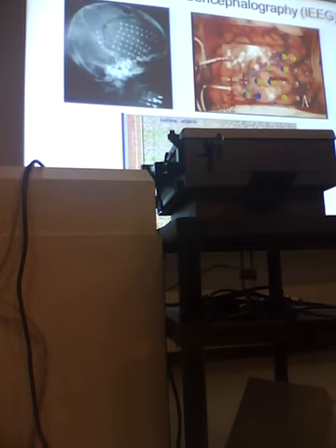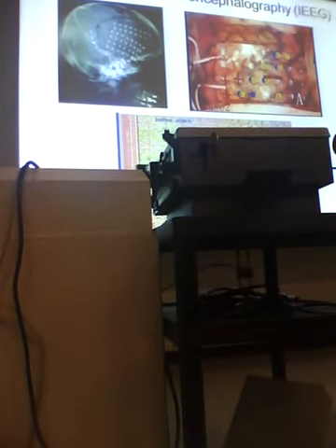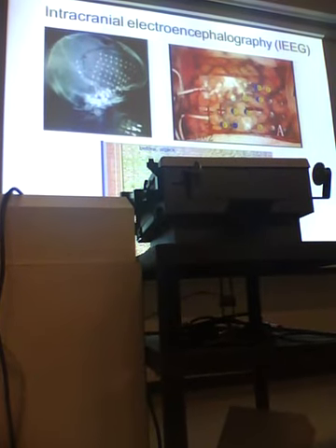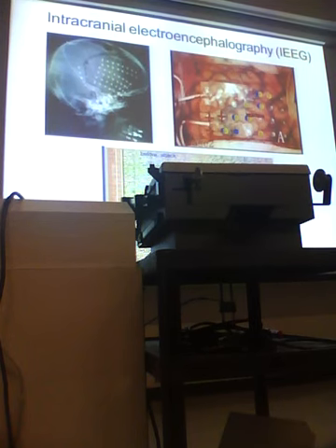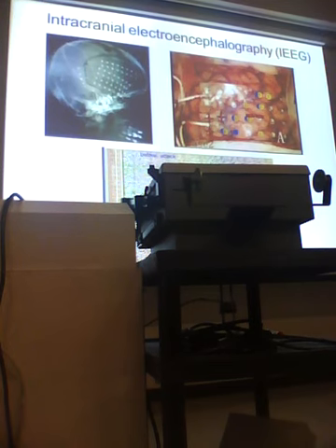And so what they're looking for with this array of electrodes are the parts of the brain that have abnormal electrical activity, because those are the ones they'll go for and scoop out in their neurosurgery. And this is just, again, recording from many different combinations of these electrodes. There's some abnormal activity in a couple or three places in this array, shown by these red stars. You're going to get a lecture later on by Matt Wheatley. He's a neurosurgeon here, and he does this sort of procedure on many patients at this university hospital.